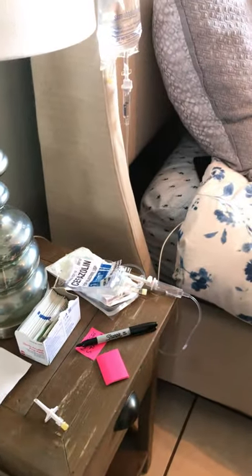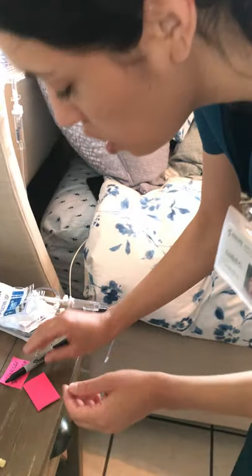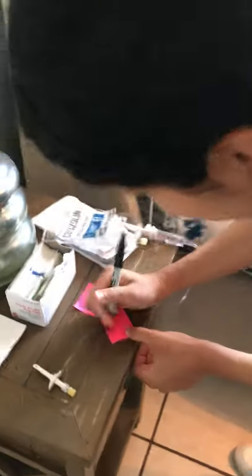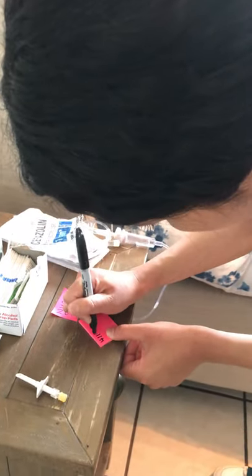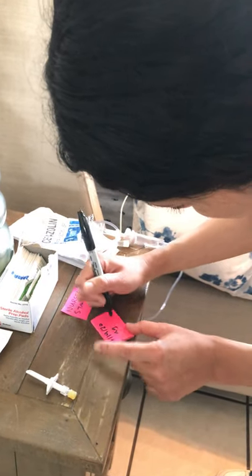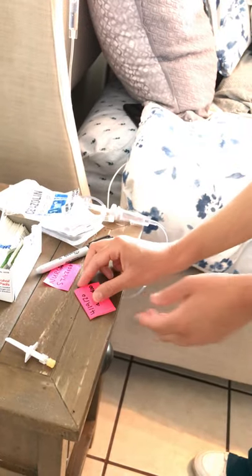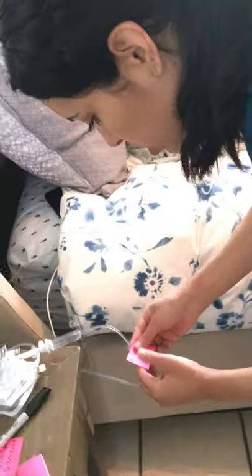At this time I would remove my gloves, wash my hands, and label my tubing. I'm writing the date, time, and my initials — 19/20 HB — and placing that label on my tubing.